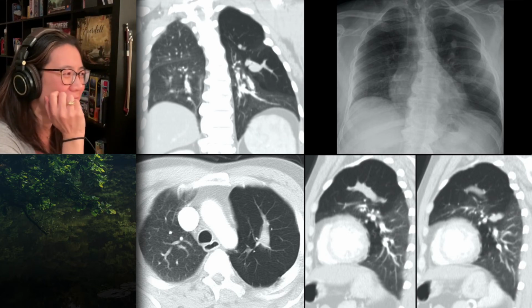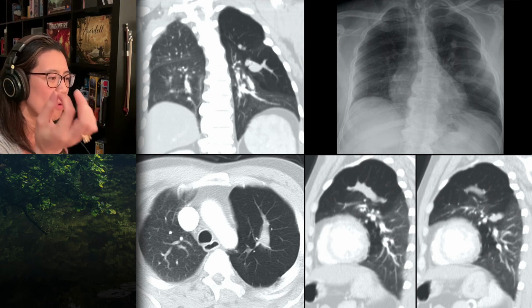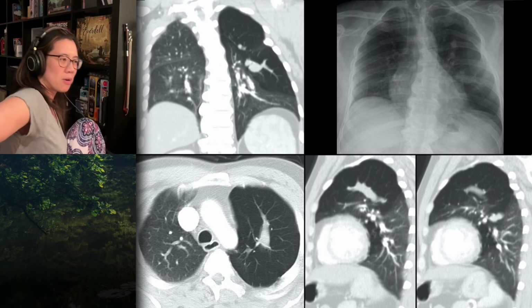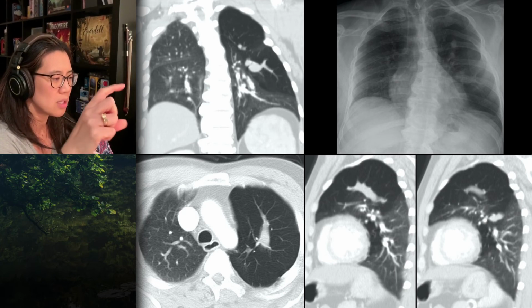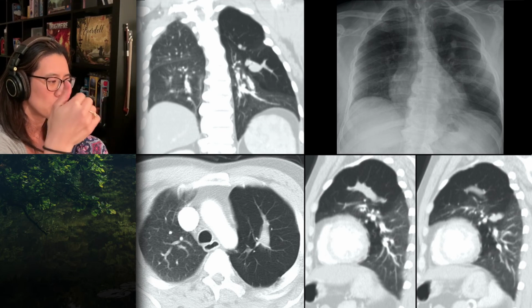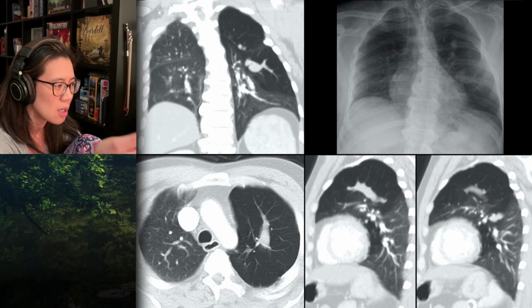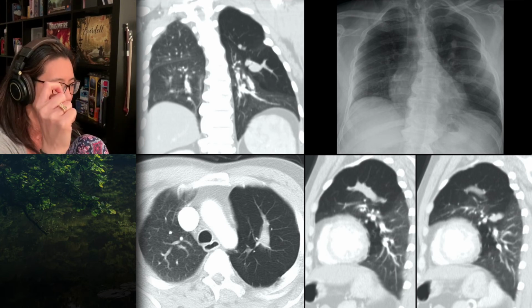So what's the diagnosis? Because a bronchocele is sort of like saying it's lobar collapse. It's not a diagnosis. It's a finding. So bronchoceles are a result of proximal obstruction, whether there's a bronchial stenosis that's then resulted in fluid accumulation in the distal portion of the bronchus. Anything can cause a bronchial obstruction, being benign or malignant processes. And in an adult patient, you'd have to exclude a malignant process.